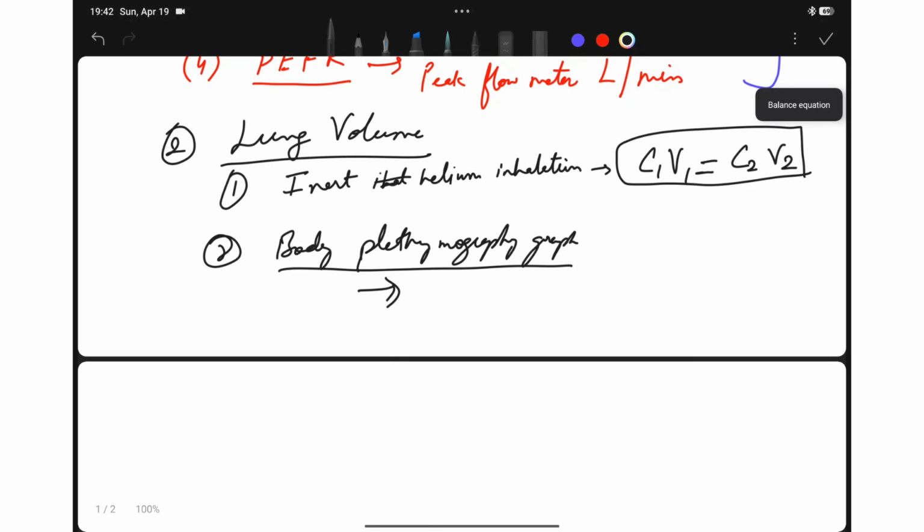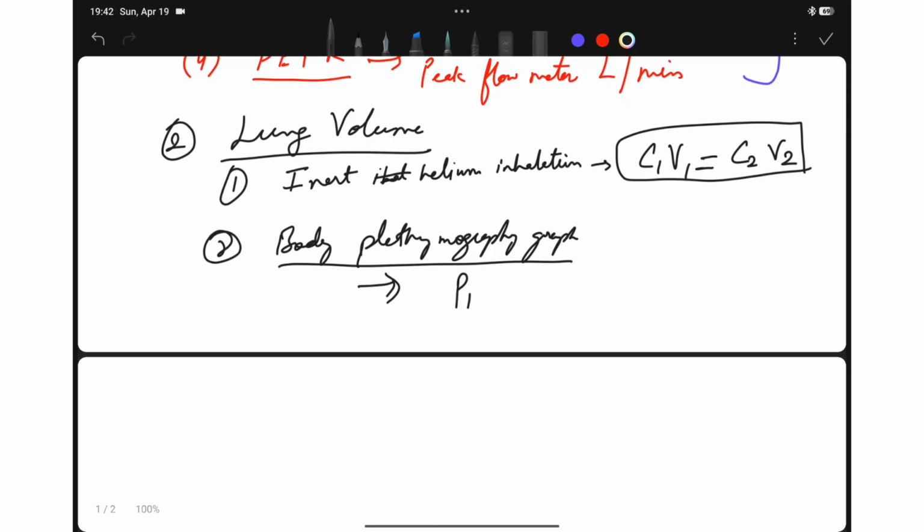Generally, it is made of plastic and is transparent to avoid claustrophobia, and the patient breathes continuously into a closed circuit. Here, what we measure is that as we breathe, we expand our lungs, so we measure the initial and final pressure and volume.